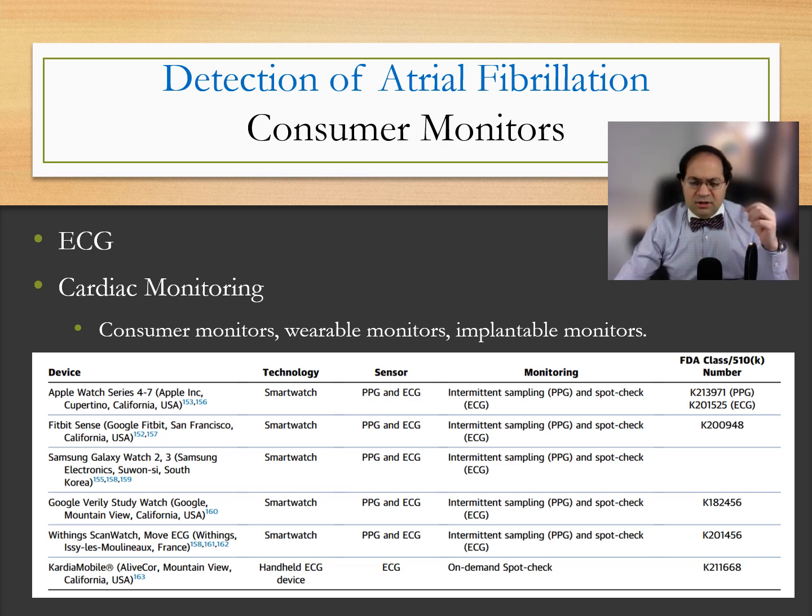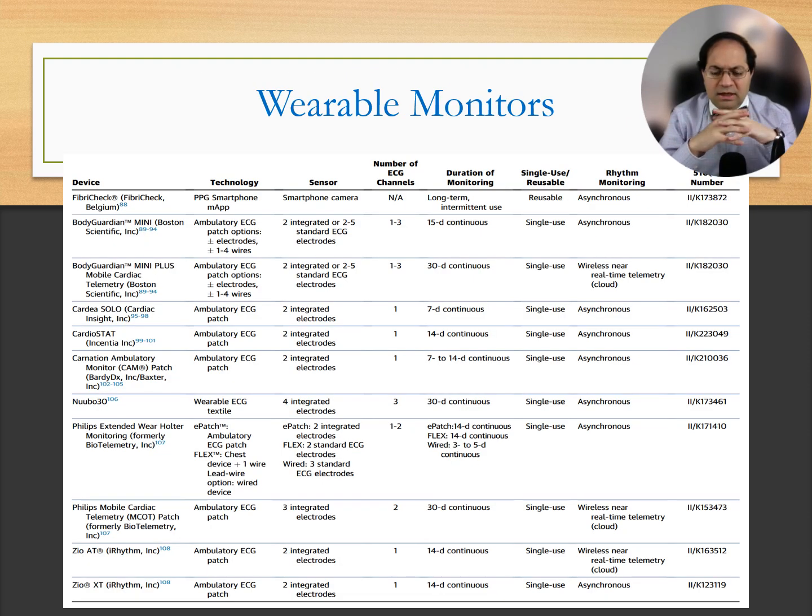So I'm going to go to the next slide and talk about wearable monitors. These are basically down to two categories. One is MCOT, or real-time data, and another one is some sort of e-patch. You can usually do up to 30 days, but with most of the companies, it's usually 14 to 21 days. They have two electrodes or more, but most of them have at least two electrodes.